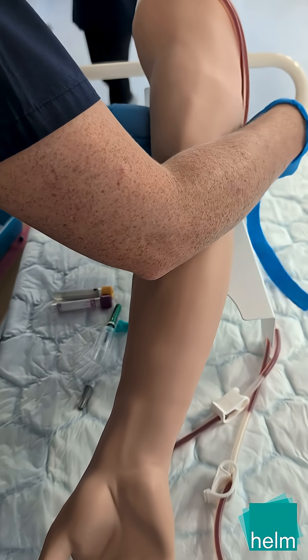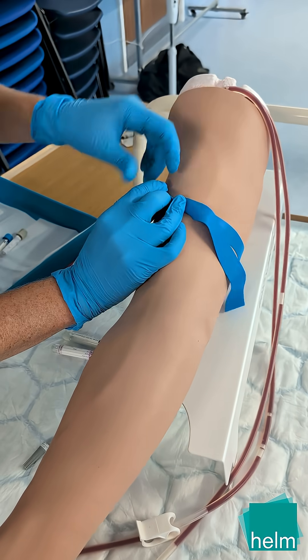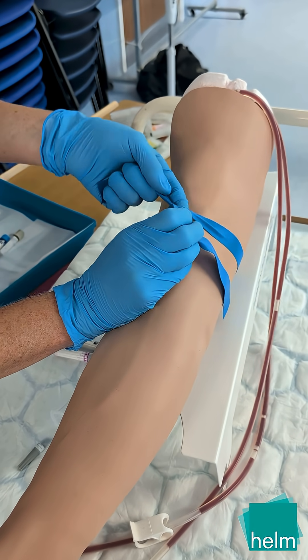Apply the disposable tourniquet with a quick-release knot. When considering a vein, ensure you avoid any vein valves, bruises, scars or hardening.